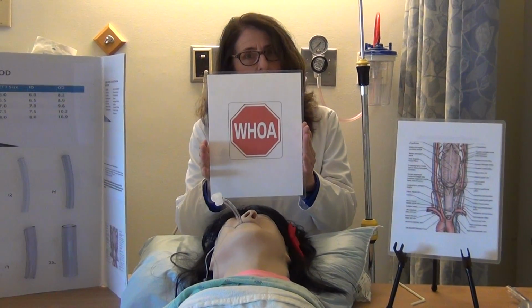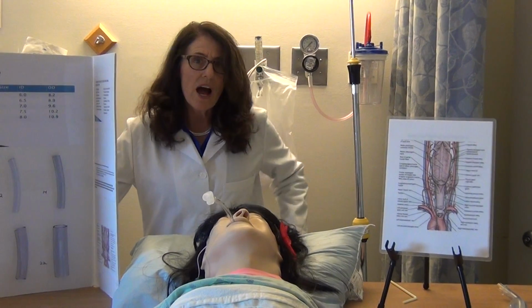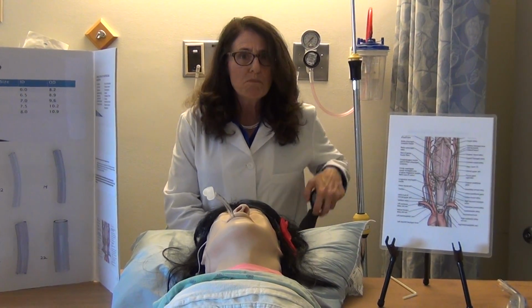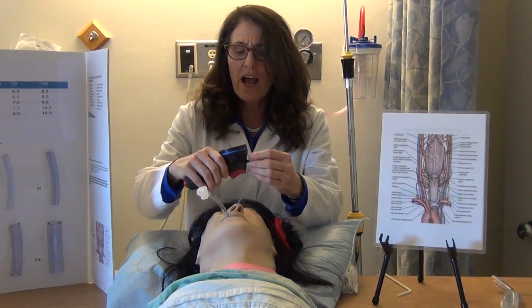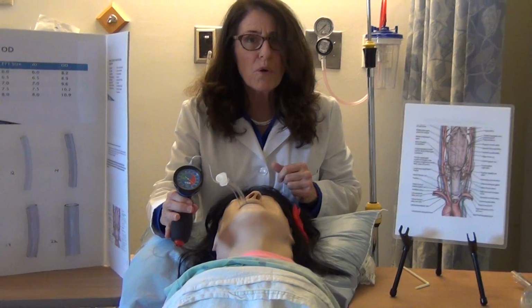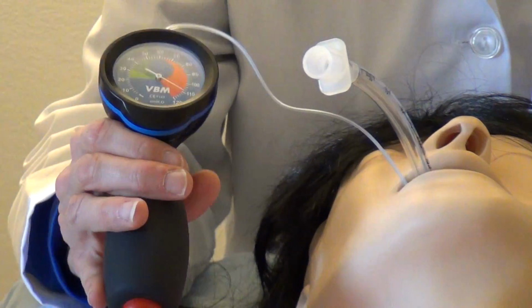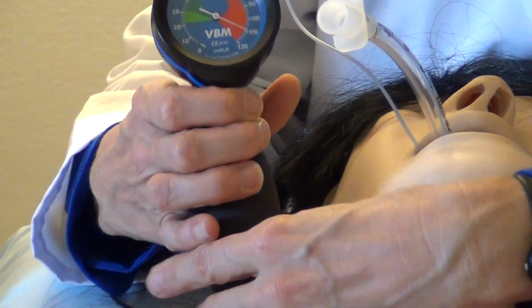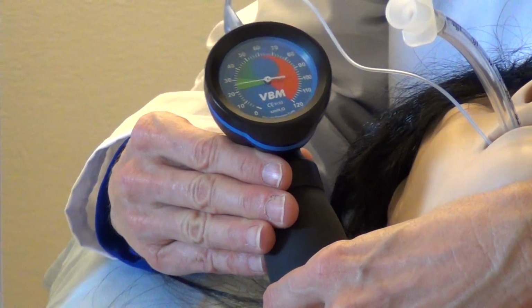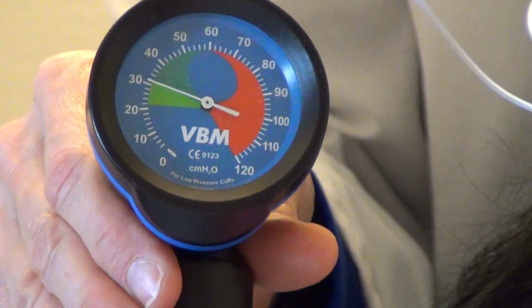Whoa, let's stop. Let's go back to standard number 1. Now, if I would have used a cuff manometer the moment I intubated Peggy Sue, I would have seen that this pressure with 8 cc's of air is over 100. That's bad. What I need to do is deflate it down to between 20 and 30 centimeters of water pressure to keep Peggy Sue's trachea safe.